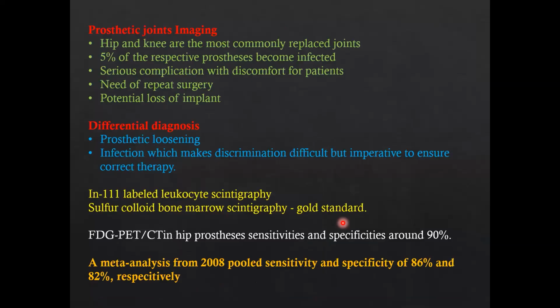So coming to another interesting application which has grown, because already I showed you one case of the post-operative osteosarcoma with the metallic implants. Metallic implants, metals, means the first thing is it is contraindicated to MRI, unless and until they are MR compatible devices. Recently, most of the new devices available are MR compatible, but unless and until we are sure, we cannot take a risk of doing the MR scan for evaluation of the joints. So here comes the role of PET.